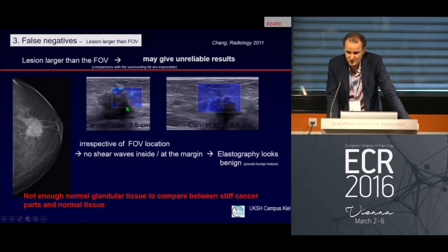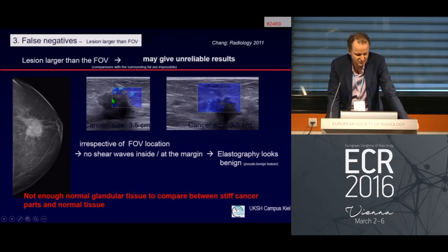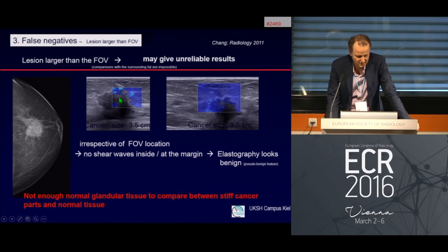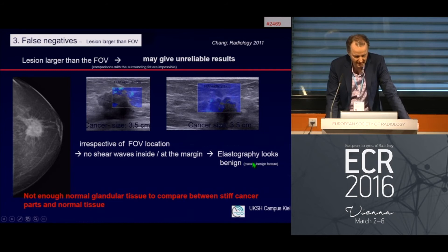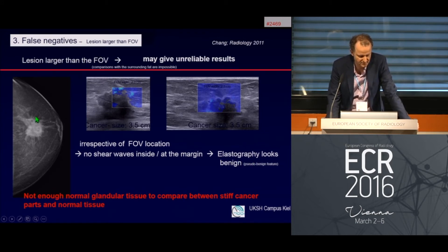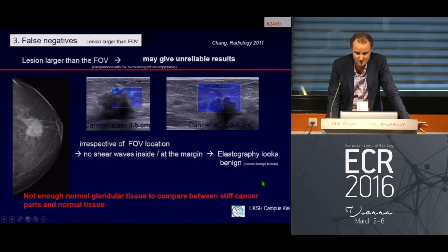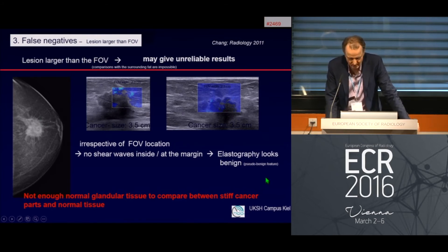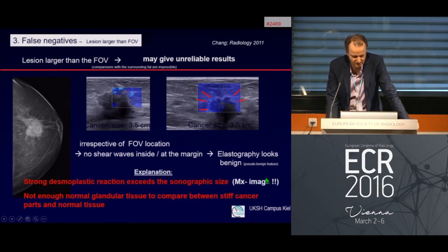Another limitation is with quite large lesions — when the lesion is larger than your field of view. In this example of a large cancer, there is a signal gap in the center and only some stiffness around it, producing a false negative result where elastography looks benign. In correlation with the mammogram, however, there is no doubt it is a cancer, a BI-RADS 5 finding — so you would not trust the elastography in that case.